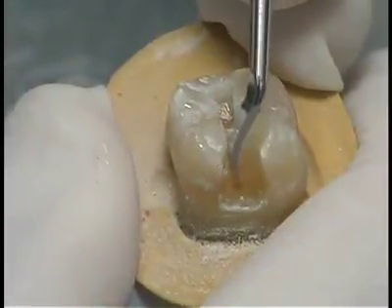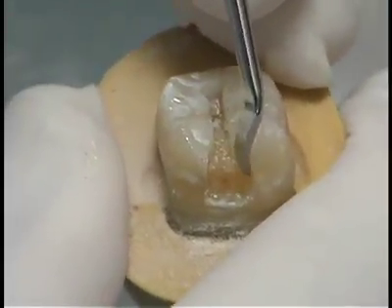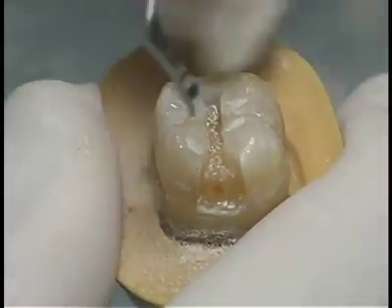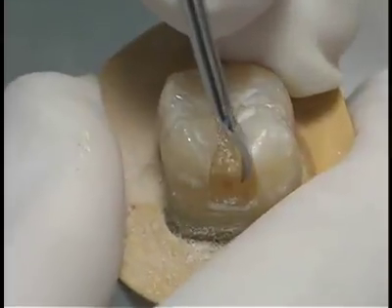The gingival margin trimmer is also used to round the pulpal axial line angle. Rounding the pulpal axial line angle decreases the stress on the tooth structure and the amalgam restoration.